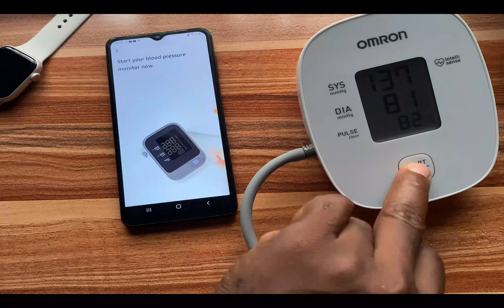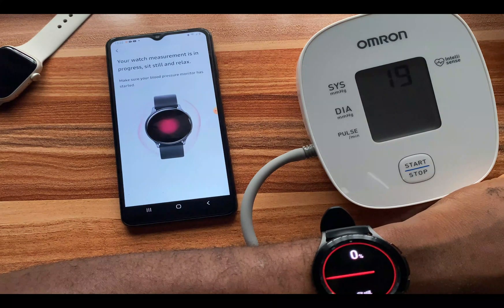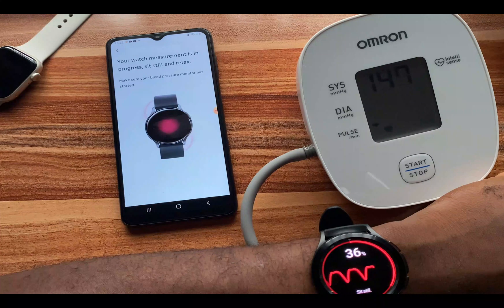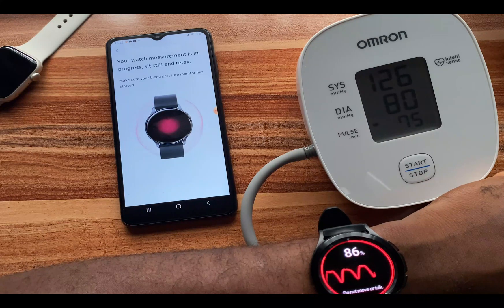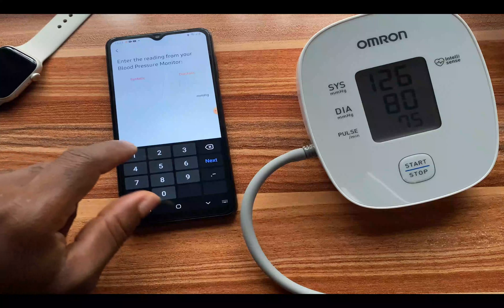I'll start the blood pressure measurement again for the third and final time. This is the last measurement, so I'll go ahead and enter it. I tap on 'Enter' now and the systolic is 126.